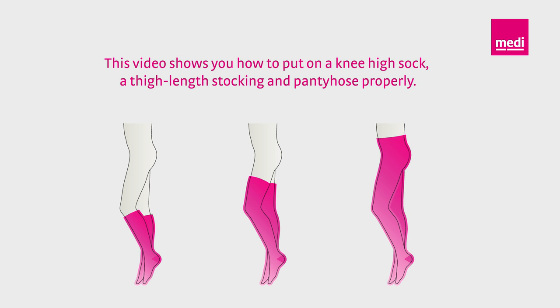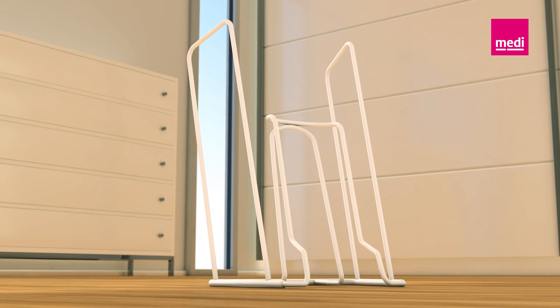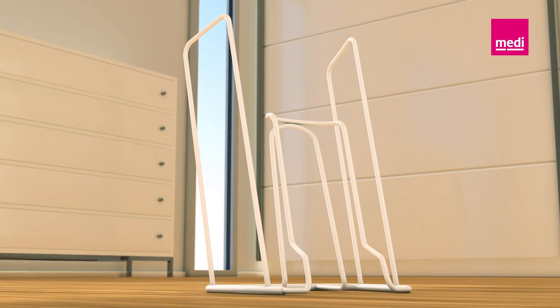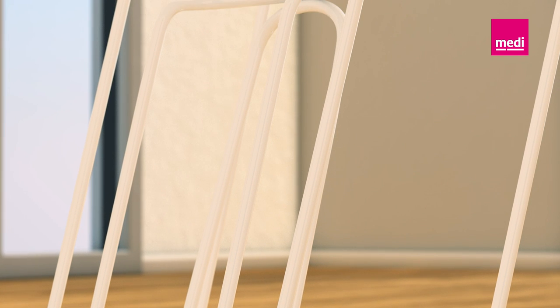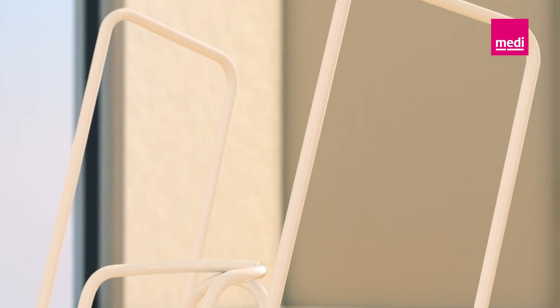The Medi-Butler is easy to use. It pre-stretches the material and increases the diameter so you can put on the compression stocking comfortably. By the way, your doctor can prescribe the Medi-Butler for rheumatism, osteoarthritis, ankylosis, and overweight. Ask him about it.